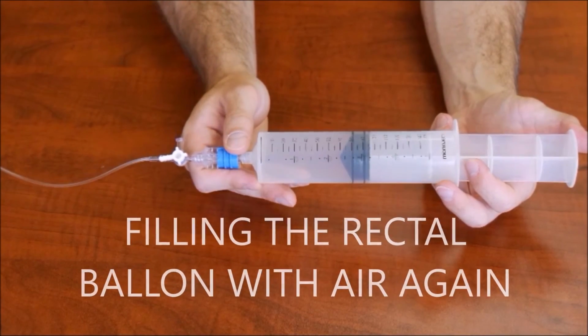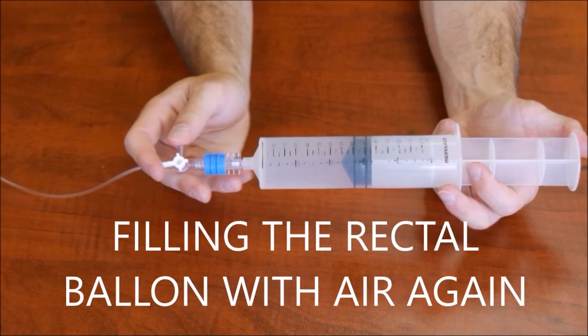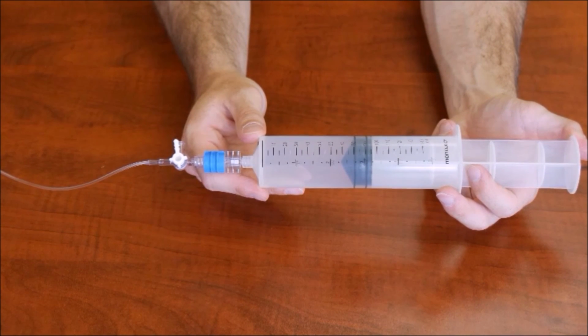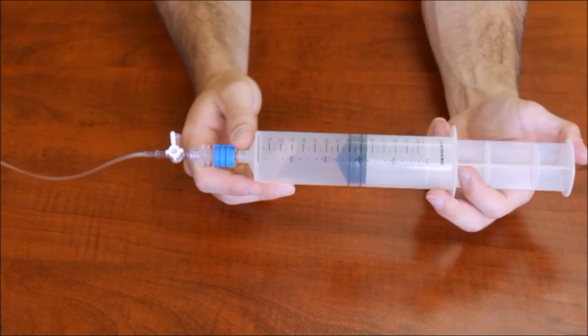When the syringe is at the desired level, switch the flow control switch to off and move the luer lock to on. Once the luer lock position is turned on, switch on the flow control switch and you're ready once again to inflate the balloon.